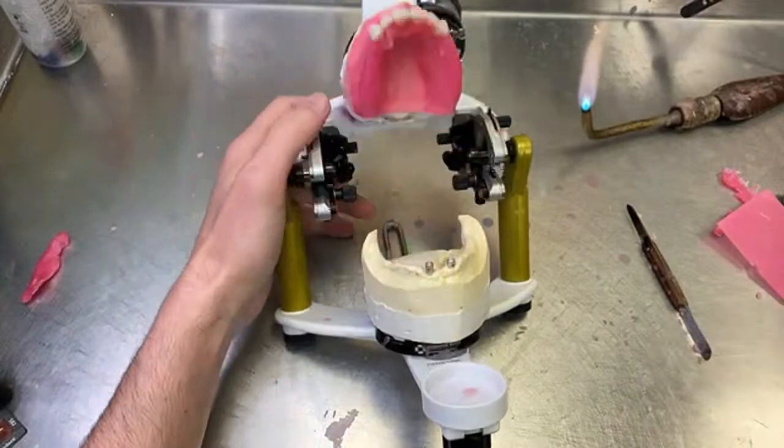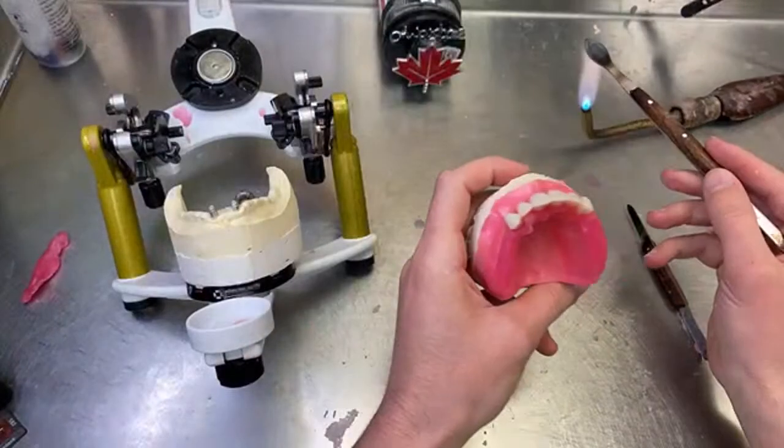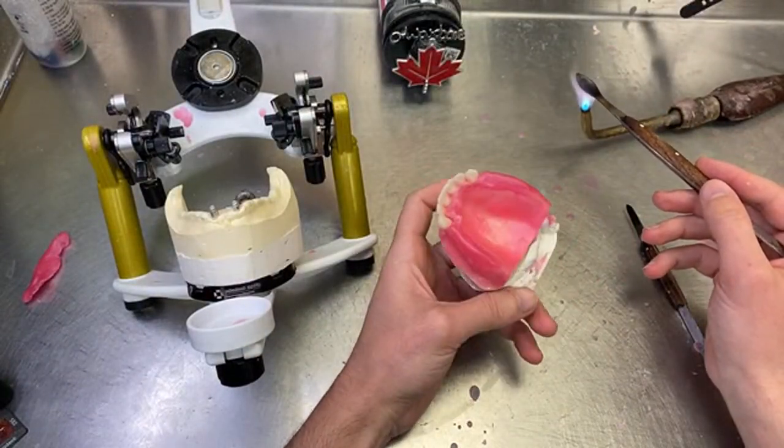Okay, so now this is good. I like to seal it in place so I don't have them moving around on me.